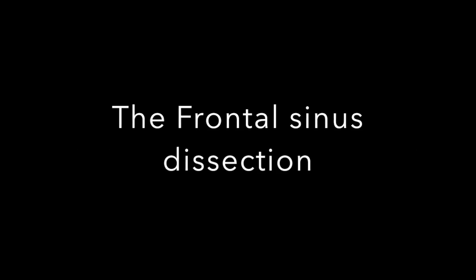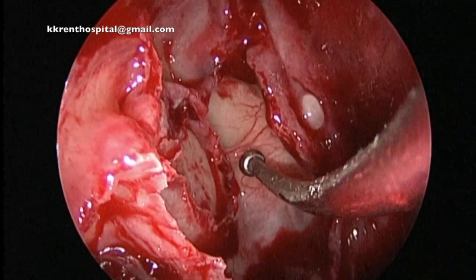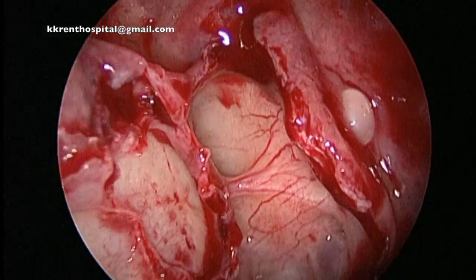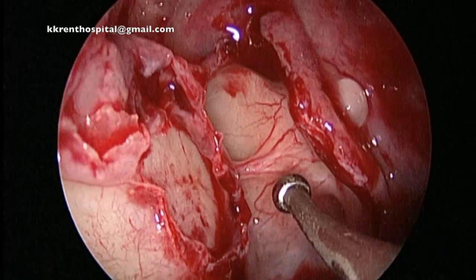Dissection of the frontal sinus and opening the frontal sinus ostium widely is an essential part of this operation. The anterior ethmoidal artery and the leak, as you saw in the previous video.